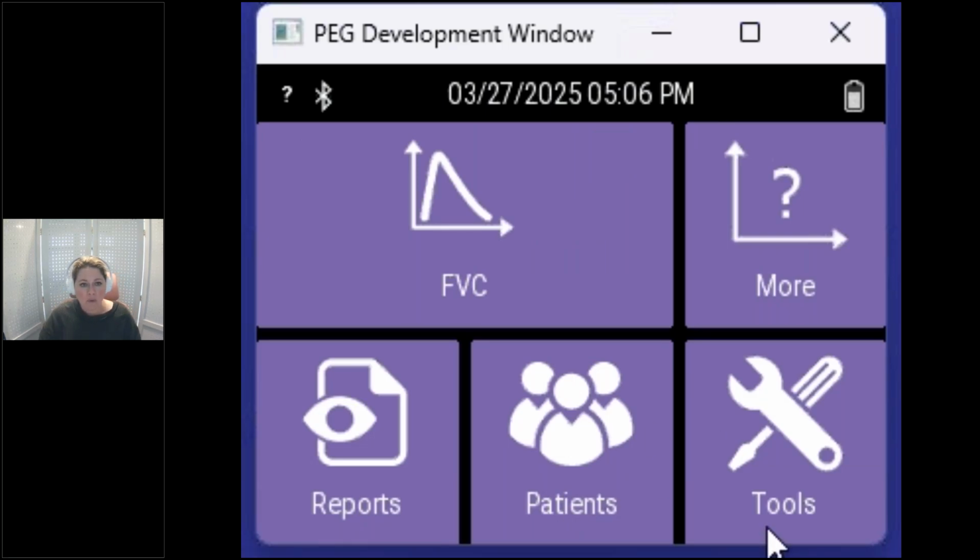menu. Before we get too far, I do want to tell you guys, we know that this is a standalone spirometer. This spirometer, you can do all of the settings on the device itself. You can have a printer directly hooked to the base for the EasyOne Air, and this device never needs to interact with the computer. However, to see the graphs a little bit bigger, to access any of the animated incentives in EasyOne Connect, or to have access to some more advanced reporting features, the device would need to be synced with that EasyOne Connect software.